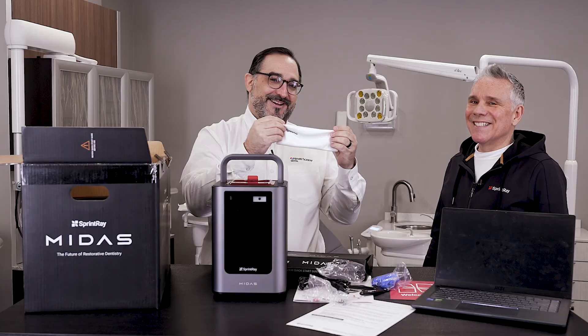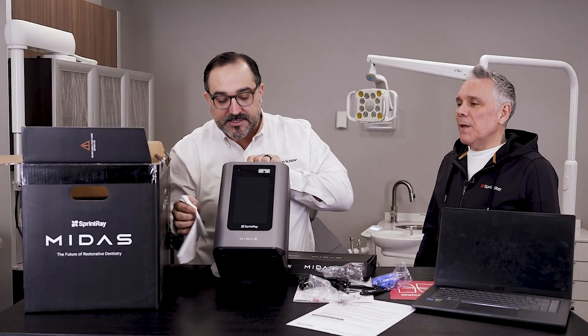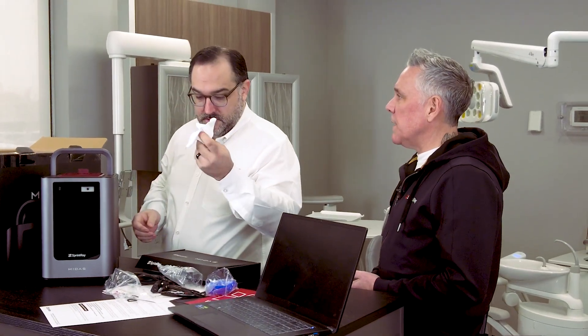Look at this cute little spray bottle. Isn't that great? You just keep your screen nice and clean. The screen is Gorilla Glass, so it's pretty indestructible and also resistant to fingerprints. Once in a while you get a smudge, you can use something like that to wipe it down easily.